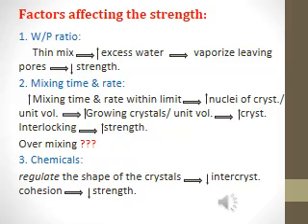Of course, overmixing, you break the formed large dihydrate crystals, and this has a detrimental effect on the strength, because you break these large dihydrate crystals and there is no crystalline interlocking, and the amount of interlocking is decreased, so the strength will decrease. This is by overmixing.